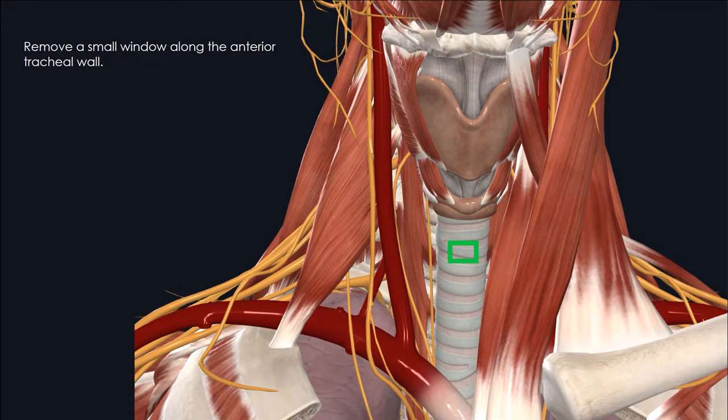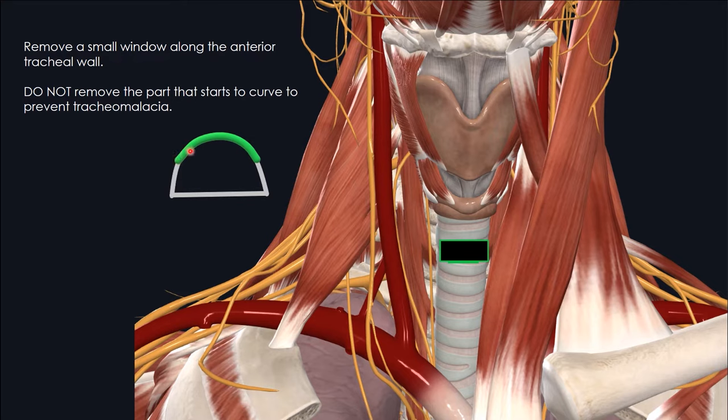It's important to keep this box located in the paramedian position. If you consider a tracheal cross-section with the anterior wall and the flat posterior wall, the small window will be located in the paramedian position before the trachea starts curving. It's important not to remove the curved portion of the trachea in order to preserve the anterior-to-posterior tracheal height. This will prevent undesirable tracheal malacia. If you inadvertently create a tracheal opening too large, including the curved portion, it will lead to loss of anterior-posterior tracheal height and can lead to tracheal malacia or tracheal stenosis once the patient is decannulated.